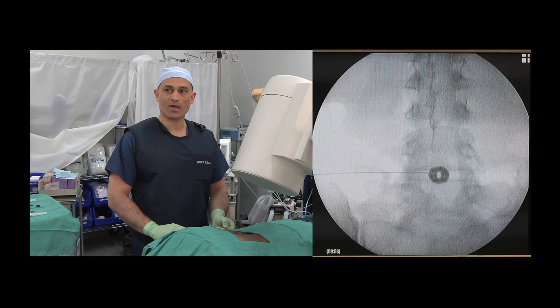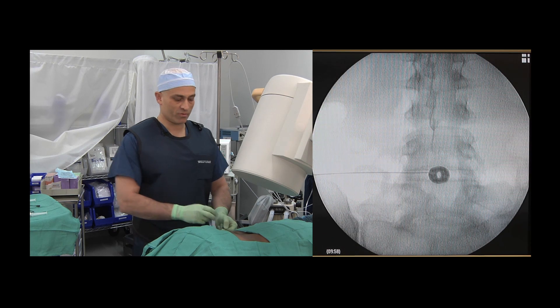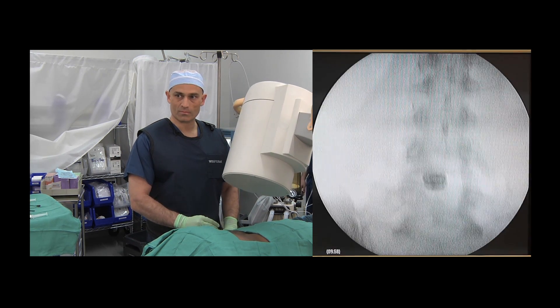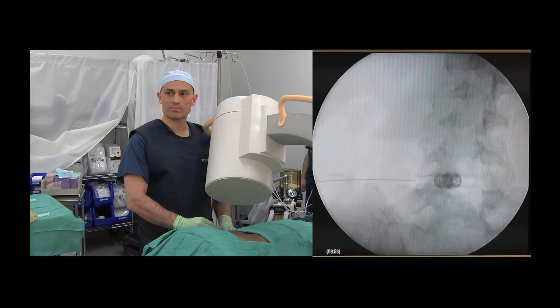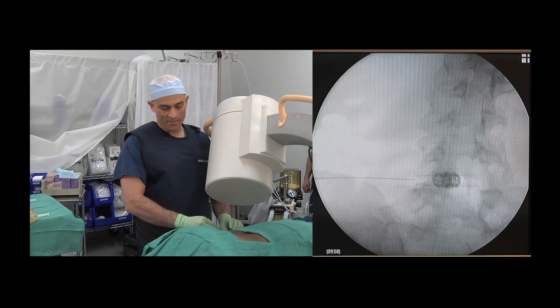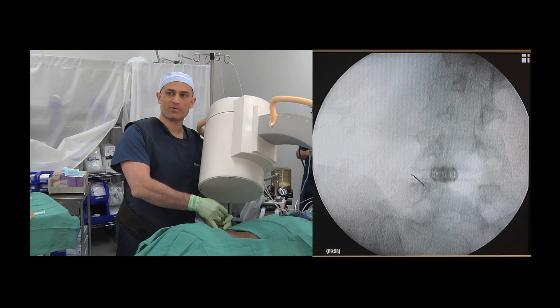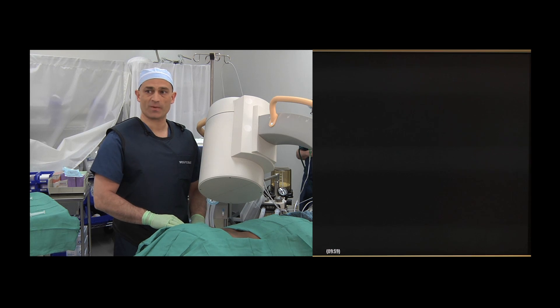The needle is lying over the L5-S1 intervertebral space. The x-ray technician is then asked to rotate the C-arm into an oblique view to approximately 20 to 25 degrees. The needle tip can be seen overlying the neuroforaminal space, and then under fluoroscopic guidance, the needle is inserted through the skin and advanced under fluoroscopic control into the neuroforaminal space.